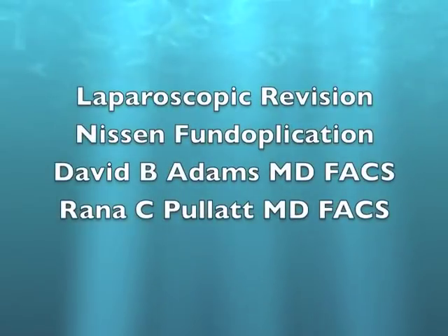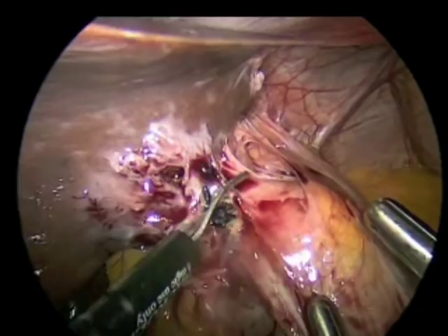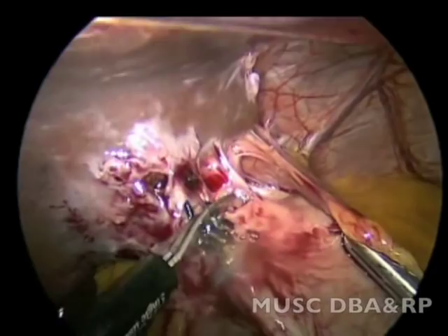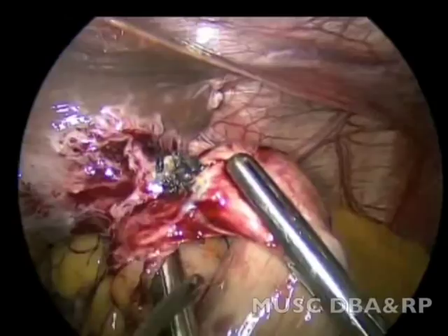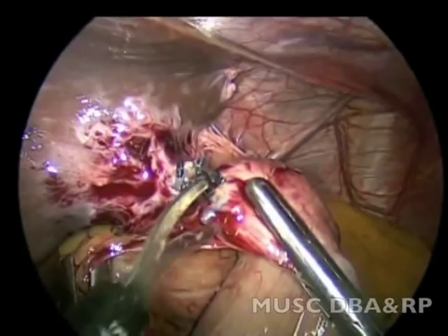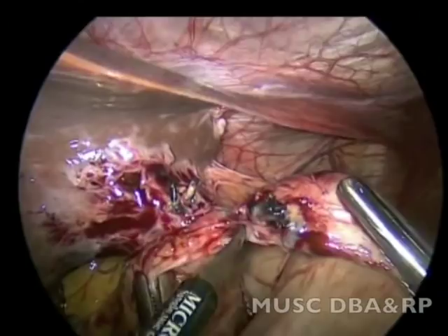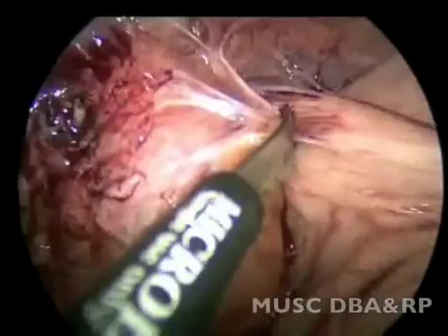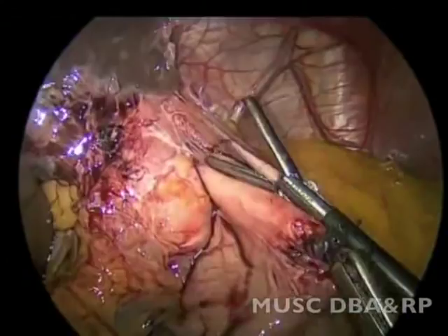This video demonstrates the takedown of a laparoscopic Nissen fundoplication. The patient had the procedure done about five months ago and had lost close to 60 pounds due to dysphagia. The patient was unable to swallow and had undergone endoscopy, which revealed an extremely tight wrap, confirmed by upper GI studies.